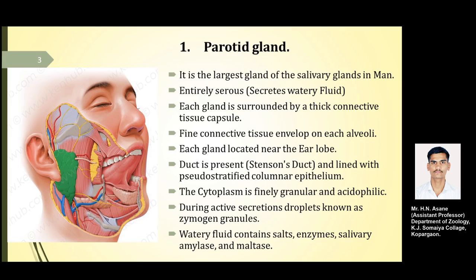The nucleus is spheroidal and centrally located. The cytoplasm is finely granular and acidophilic. In the basal portion of the cells they present a characteristic striated appearance. That is the striated appearance of this duct, the intercalated ducts containing the salivary ducts.